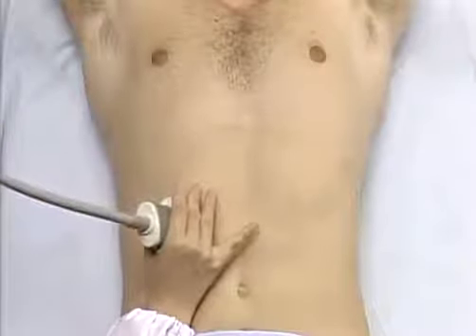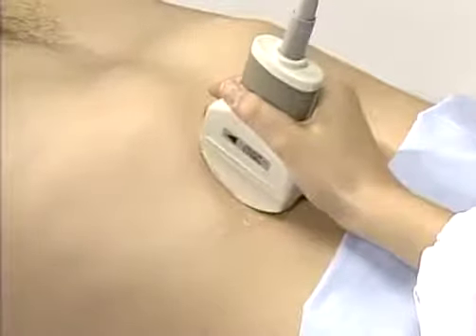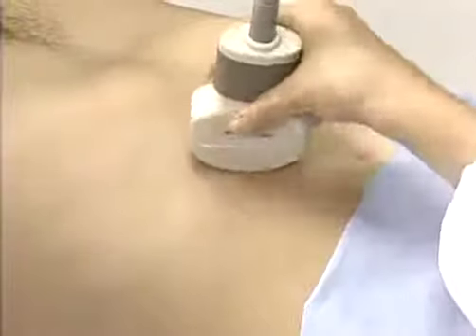Use the contact surface as the support point to change the angle of the probe. Then, move the probe slowly all over the target organ, from end to end.